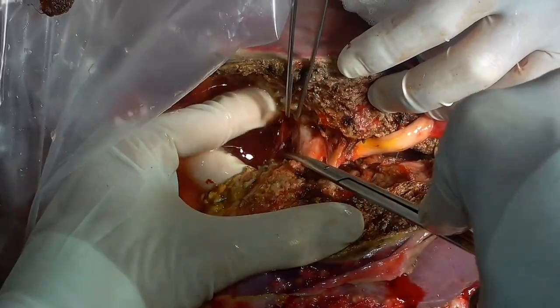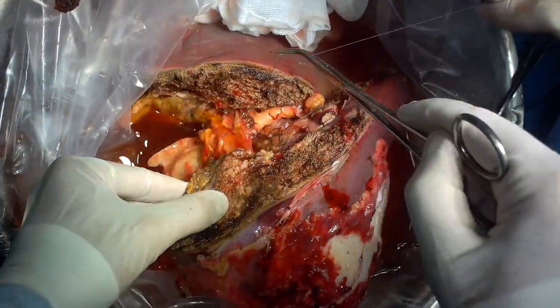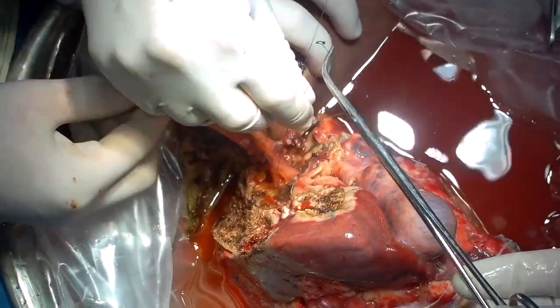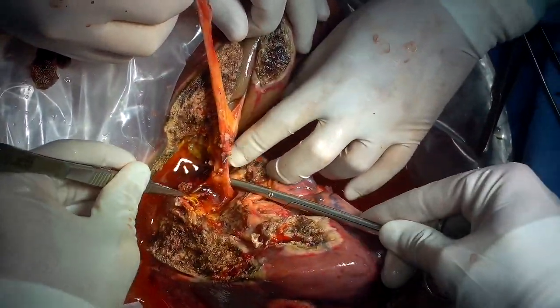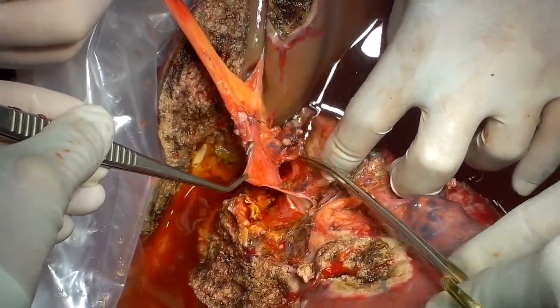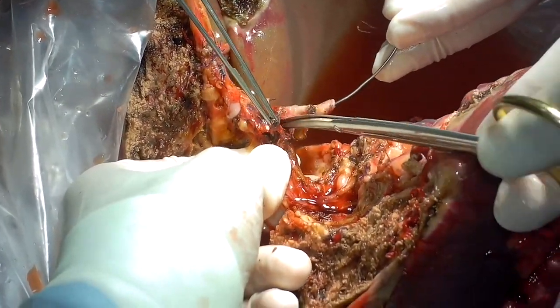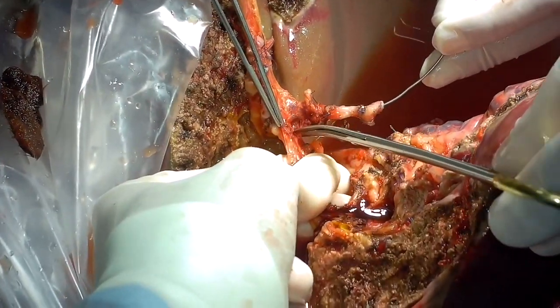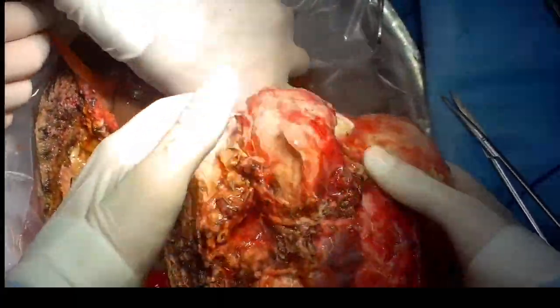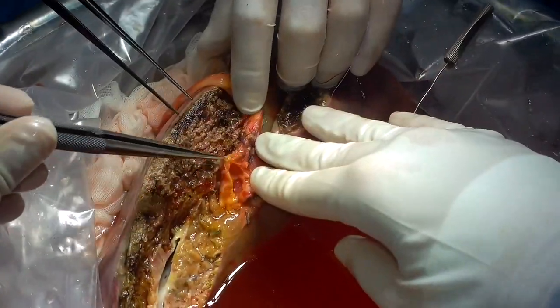Here we can see the umbilical plate. We expose it with the ultrasonic dissector. The bile duct is opened and then transected. The vessels included in the umbilical plate are also ligated. We proceed to dissect the sinus of the left portal vein, trying to preserve as long a segment of the left portal vein as possible. A metallic bougie is introduced into the artery of the remnant liver. We complete the artery dissection, and now the remnant liver is completely detached. We ligate the artery of segment 4 and check the bile ducts.